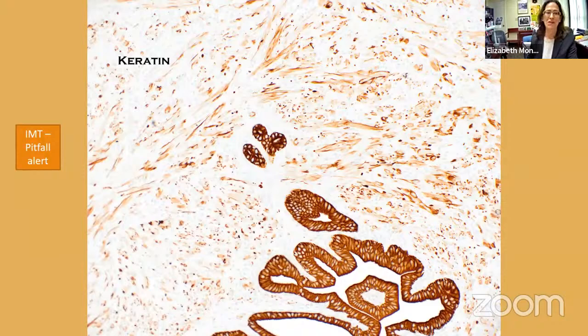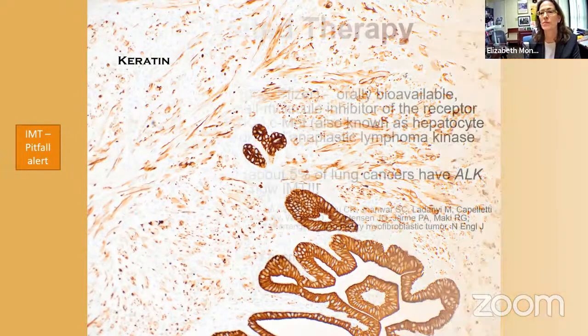And as a pitfall, do remember that quite a large percentage of inflammatory myofibroblastic tumors express keratin, which some people attribute to their submesothelial typical location. And this example is no exception.